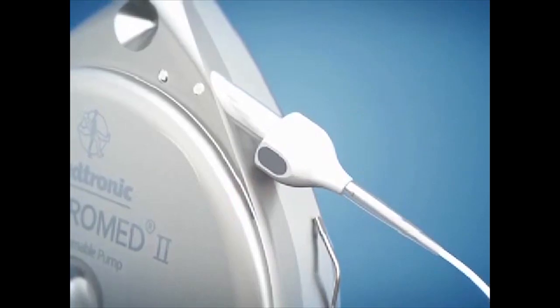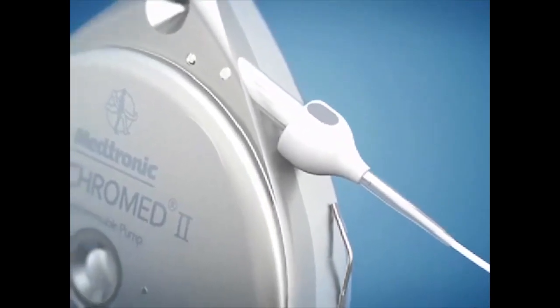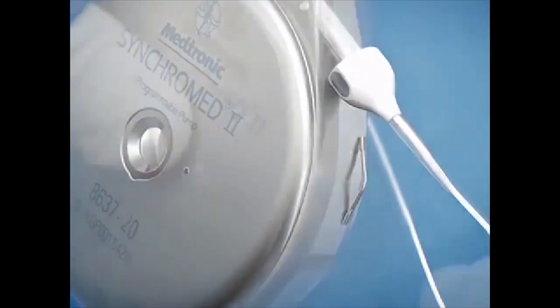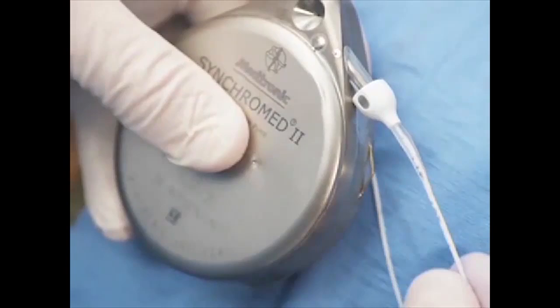Then, release your thumb and forefinger and check that the sutureless pump connector is properly attached by grasping the tapered portion of the connector and tugging as if to remove the connector from the pump. Also, rotate the sutureless pump connector 90 degrees to the right and left and feel for a correct, snug fit and that the catheter port isn't visible from any position.